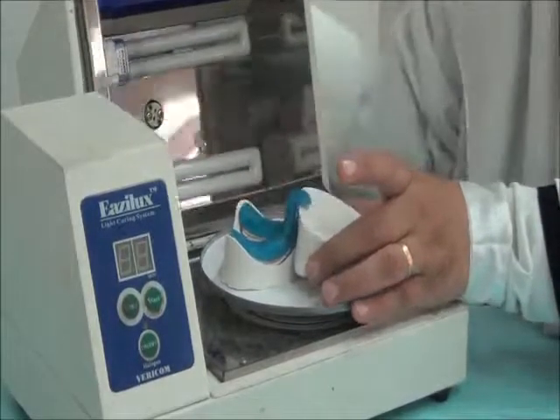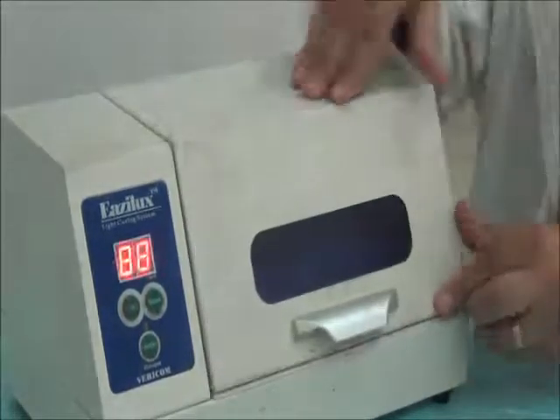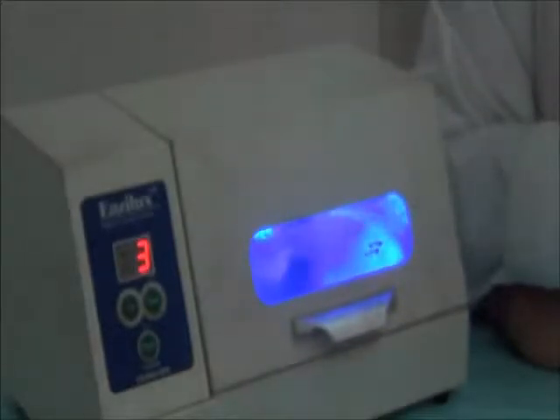It's still soft, so I'm not going to remove the support. The idea, we need to remove the support while it's curing, because the support material will be preventing the light from entering into that area where it's touching. So we need the handle solid enough to take the support away and complete the curing cycle.